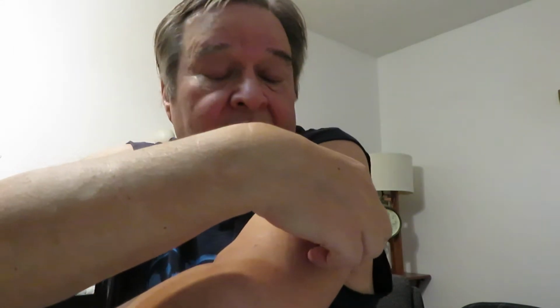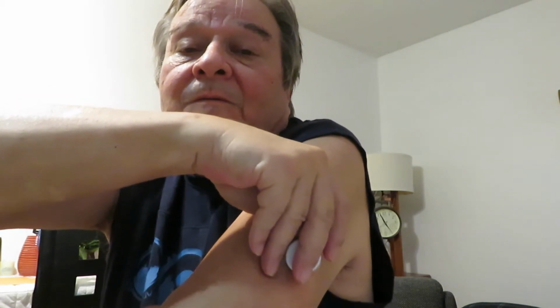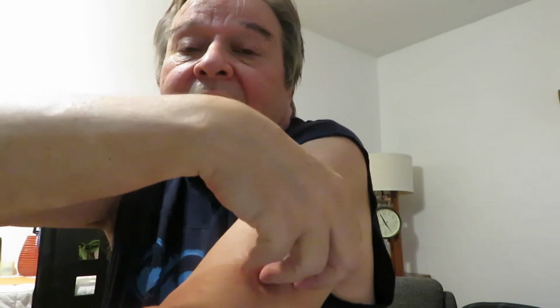Okay, I'm going to take this one off. And when you take showers, I forgot, you don't have to cover this up. You don't have to do anything. Pull it. You better do a little on each side because it's really sticky. And you don't have to cover it up or anything when you're taking a shower. That's a great thing about it.